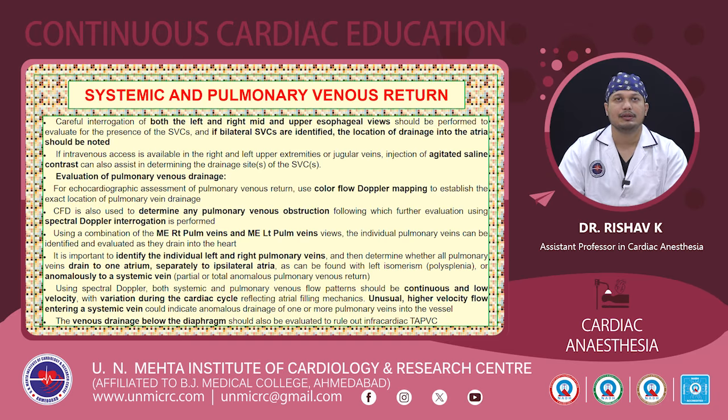Now coming to the careful interrogation of both the left and the right, as well as the mid and the upper esophageal views have to be performed to evaluate for the presence of SVCs, and if bilateral SVCs are identified, like I have told many times, the location of drainage into the atria should be noted. If intravenous access is available in the right and left extremities or jugular veins, we can perform agitated saline contrast in determining the drainage sites of the SVCs, and also to evaluate the presence of any defect in the atrial septum, we can use agitated saline contrast.